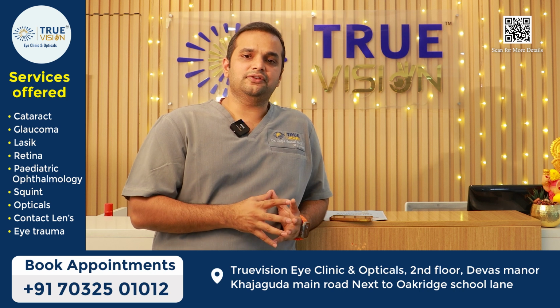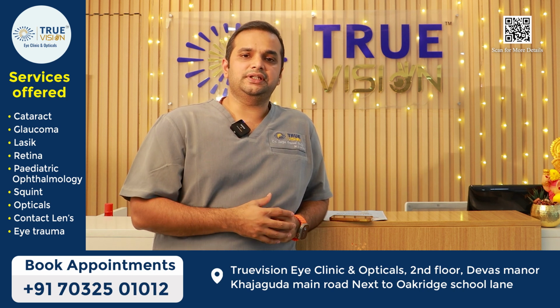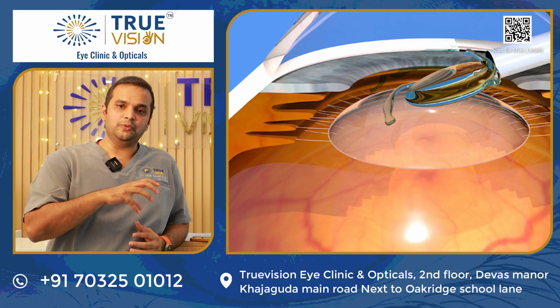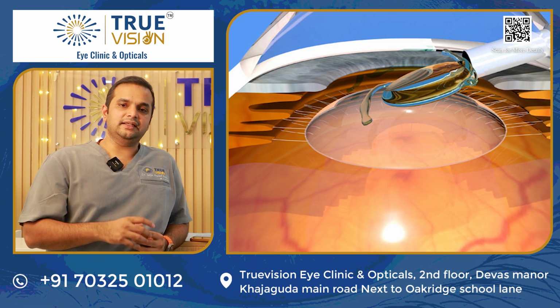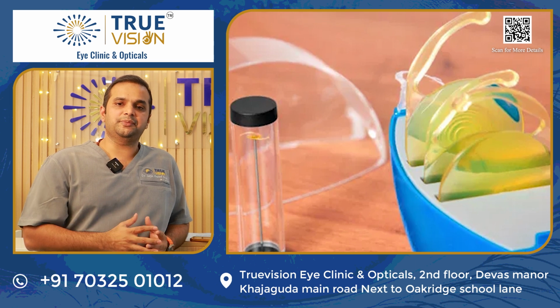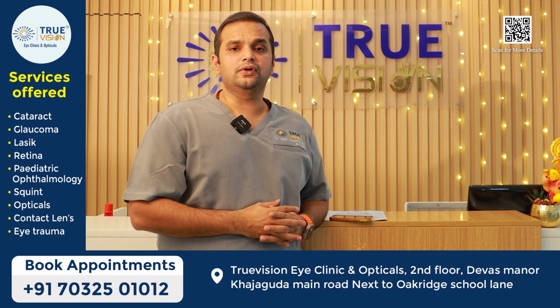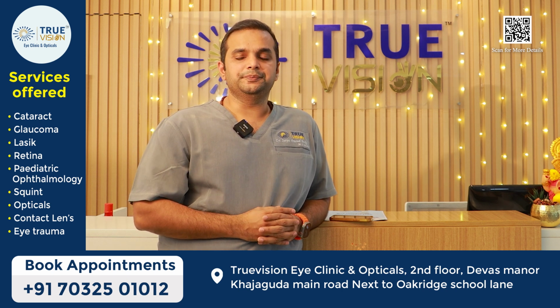So, the understanding of cataract surgery is when the natural lens of your eye starts to degenerate and become opaque. That's when, during the surgery, we remove this lens with laser, we melt it away, and in its place, put an artificial IOL or intraocular lens. Now, these intraocular lenses come in various types and models and different specifications also. So, how do you go about selecting the lens which is most suitable for you?